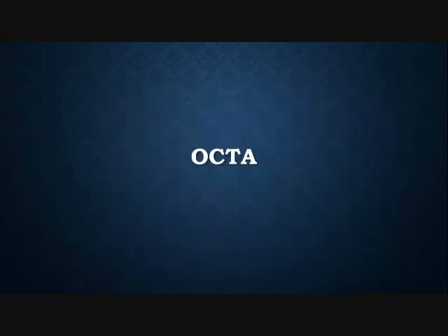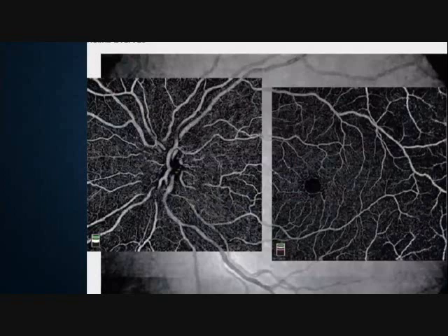Then there is OCTA. As I mentioned, there are parapapillary capillary loops as well as the foveal avascular zone, the foveal capillaries, and we are concerned with them, and these can be figured out with OCTA angiography.